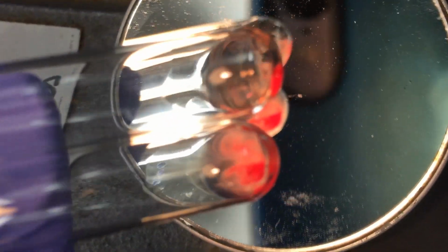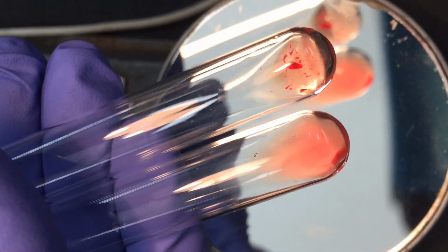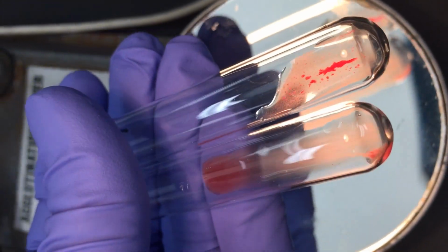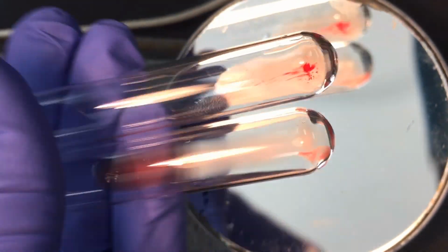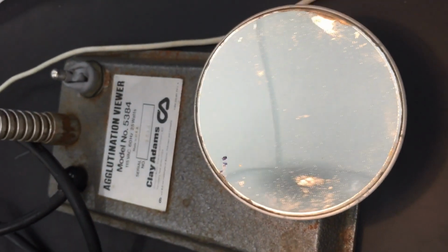Tubes 3 and 4. Remember, we're looking for an antibody in our serum. Okay. So grade agglutinations. This would be room temperature or RT saline.